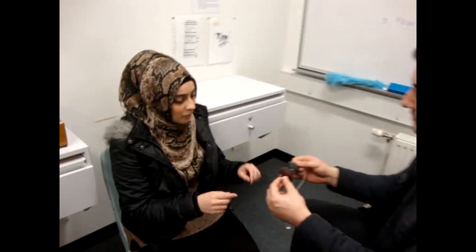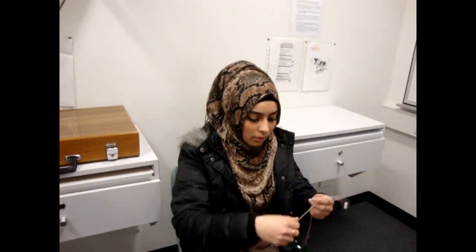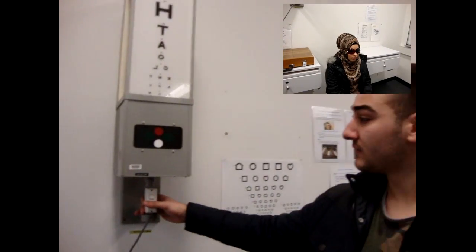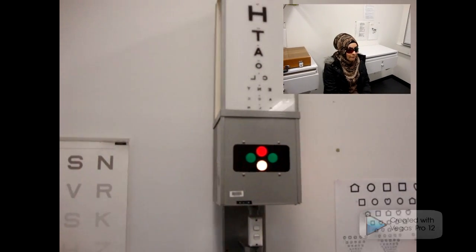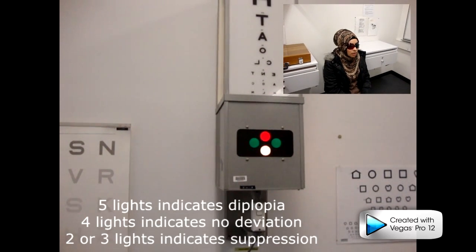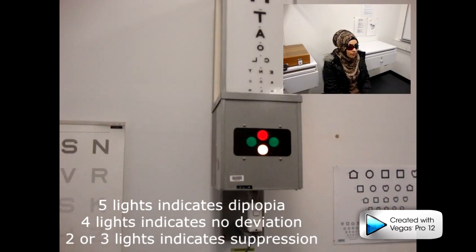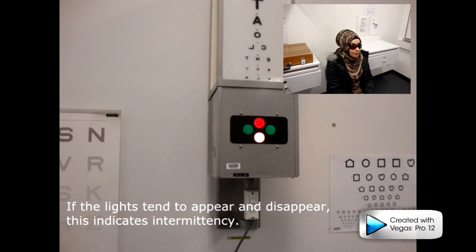Okay, now I want you to put these glasses on. I want you to put red on right and green on left. Once you have them on, I want you to look at these lights. Tell me what you see. How many lights do you see? I see 5 lights. The patient sees 5 lights indicating that she has diplopia. Are they there all the time or are they flashing on and off? They're there all the time.